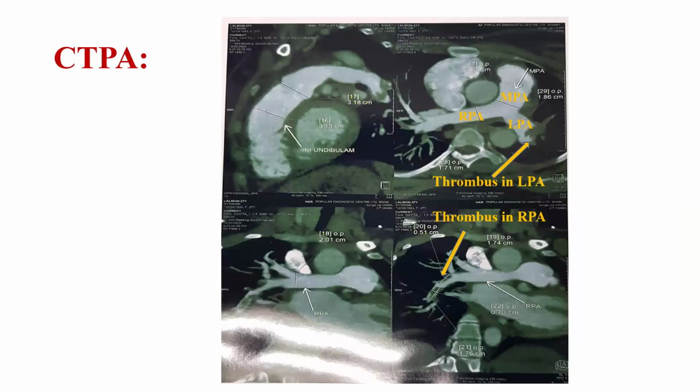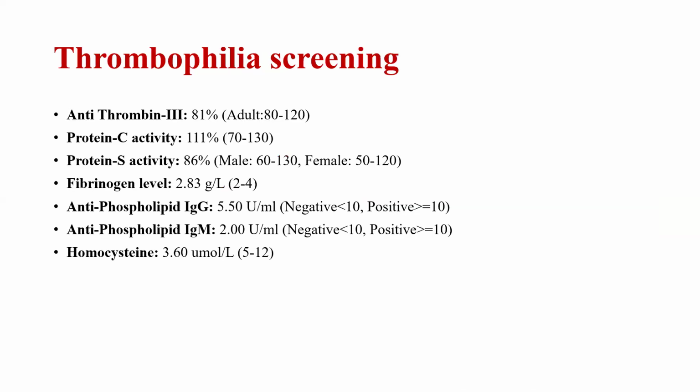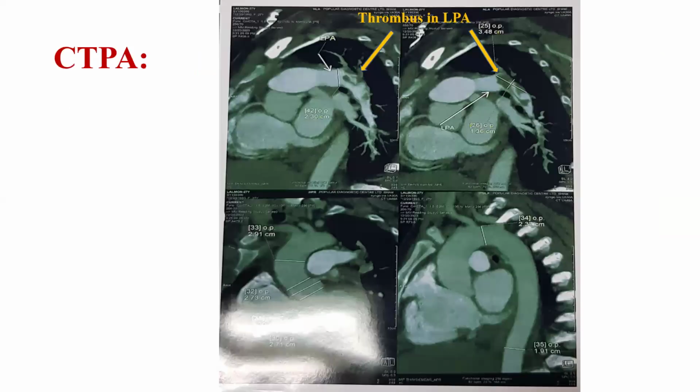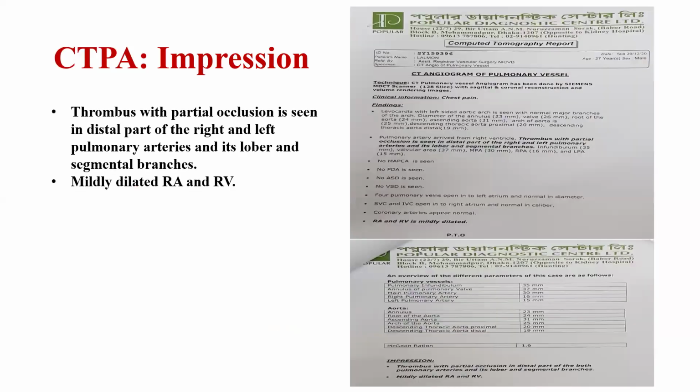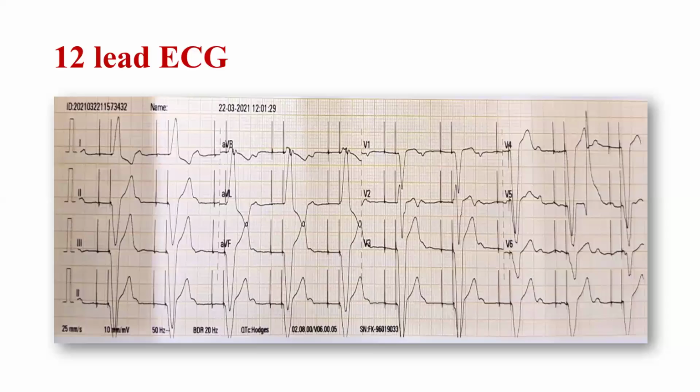Exactly, sir. If someone sees only S1, Q3, T3 and sinus tachycardia and concludes pulmonary thromboembolism, that will be wrong. Clinical context is very important, not the ECG alone. It just gives you extra confidence. So you should go for a confirmed diagnosis.